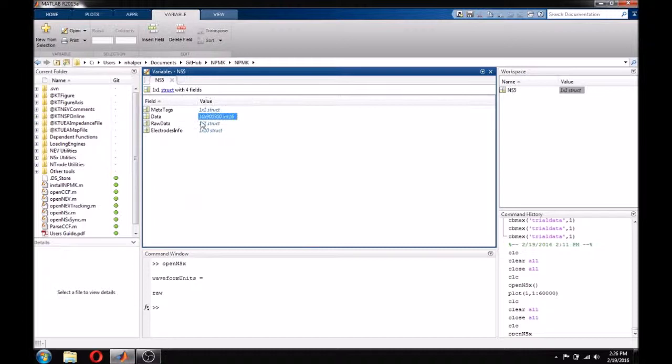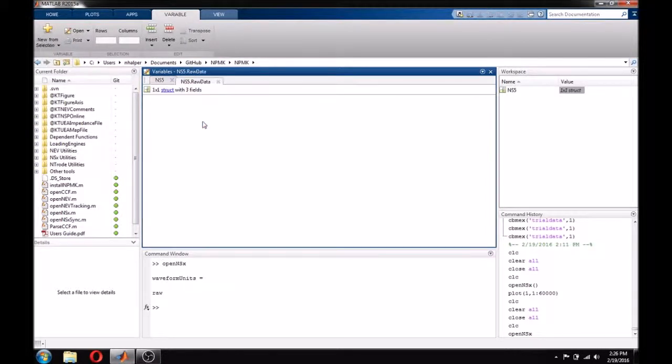Raw data, generally, doesn't need to be used. It contains information that the NPMK makes use of.